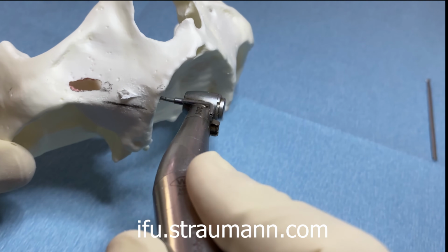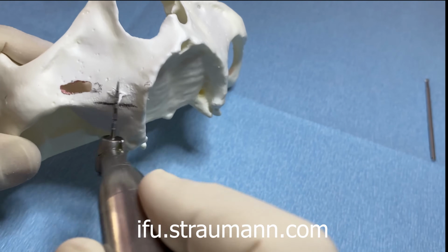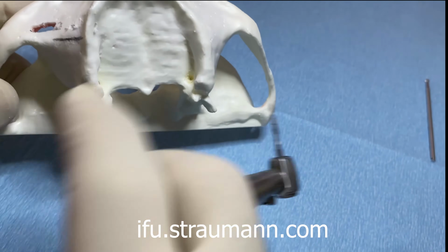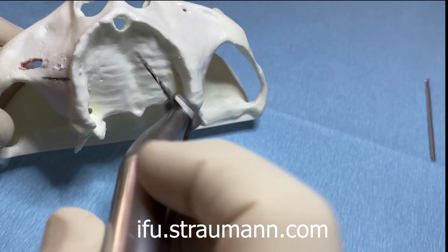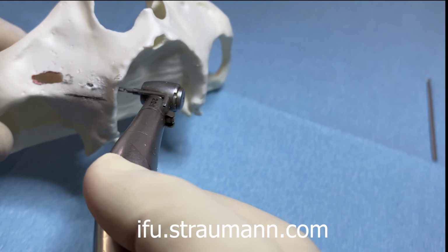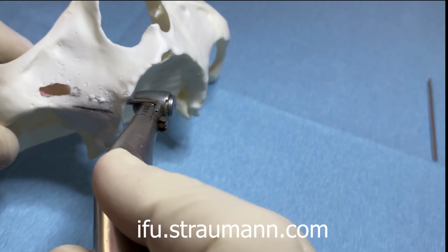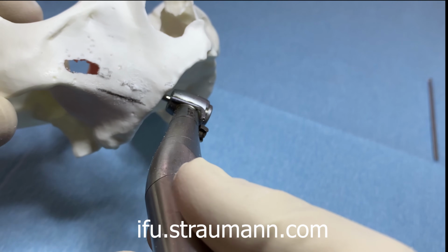So there is a concavity to this patient because this is almost like a Zaga 2-3 patient. So there is a concavity here. Now, if I can slightly redirect my drill and try to maintain as much of that bone, but it's nicer, but not absolutely necessary.